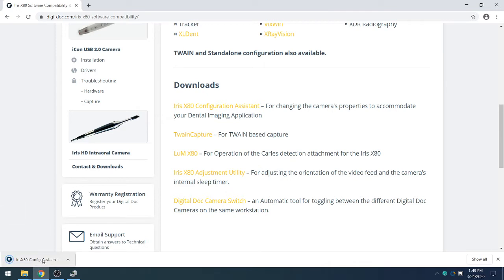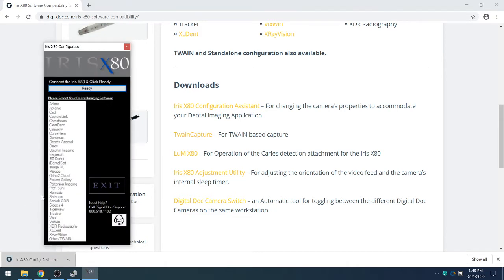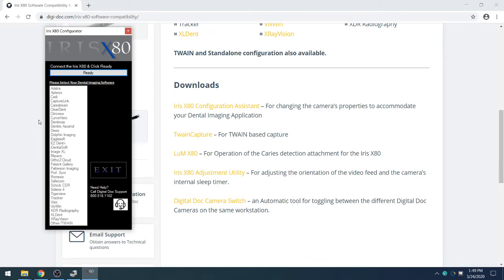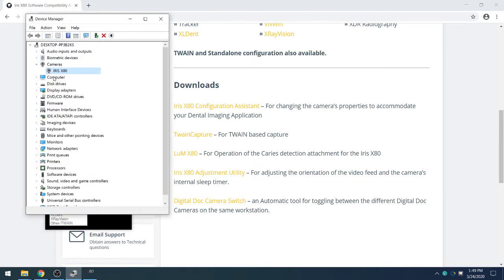Once it is completed, we will go ahead and launch that. At this time we want to make sure that the camera is connected to your computer, so we can check this by pulling up the Device Manager and looking under Cameras and seeing the Iris X80 there.